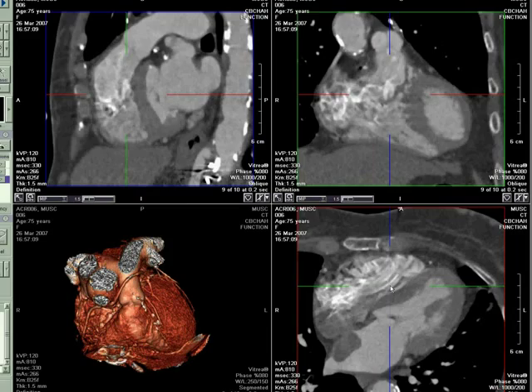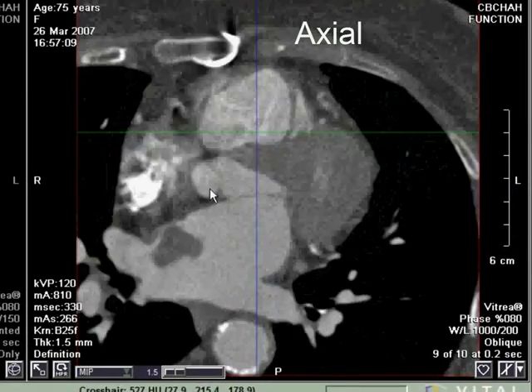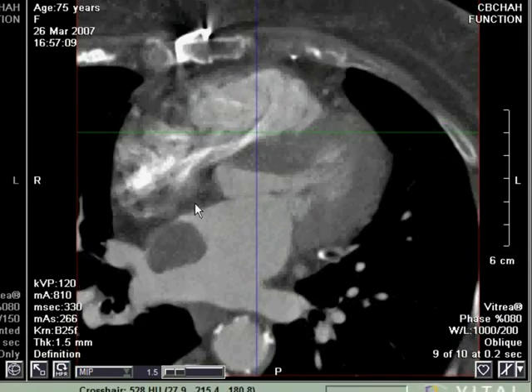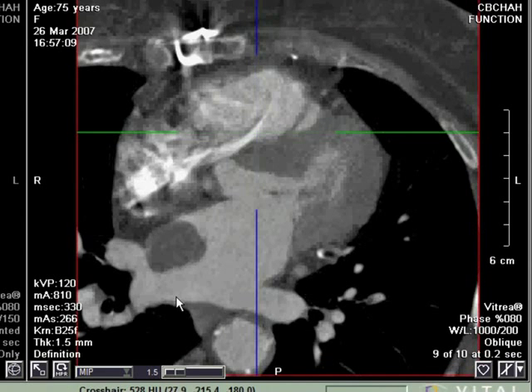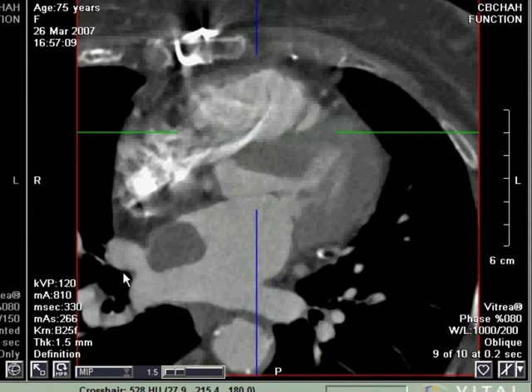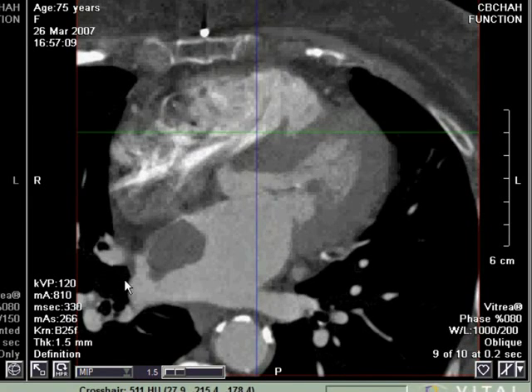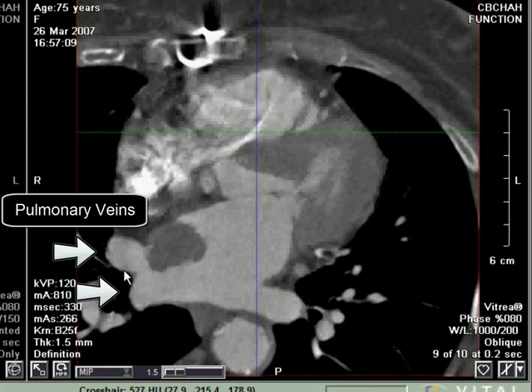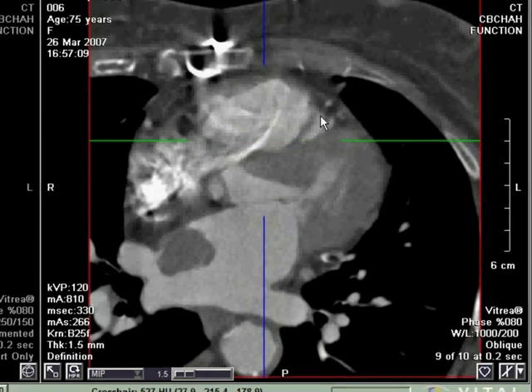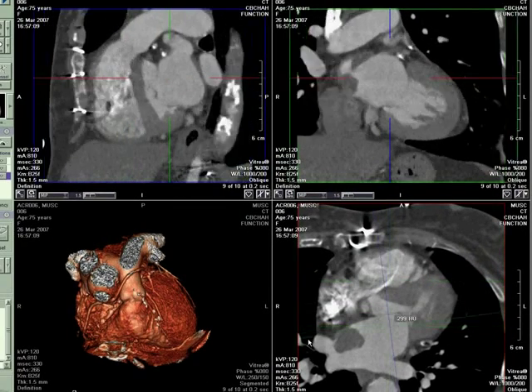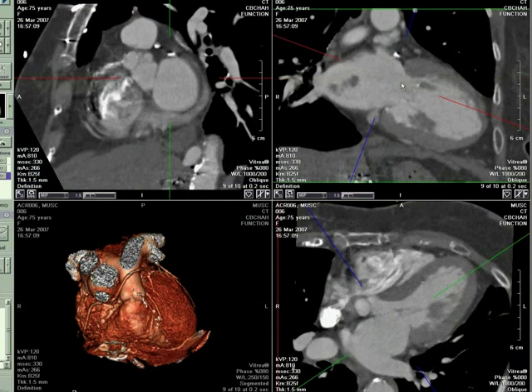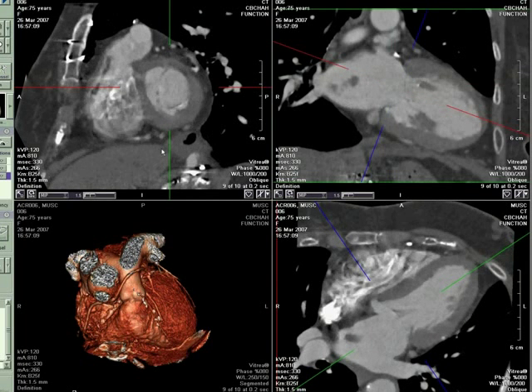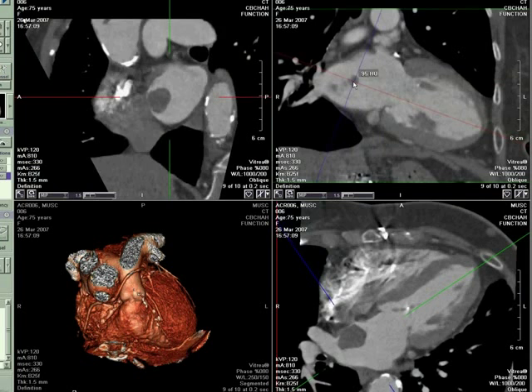In order to do that, we'll first look at the axial images, which show a lobulated mass adjacent to the interatrial septum, which abuts the origin or inflow of the pulmonary veins from the right lung. We will then use multi-planar techniques by obtaining a four-chamber, two-chamber, and short-axis view of the heart in order to best characterize the mass and its relationship to structures.